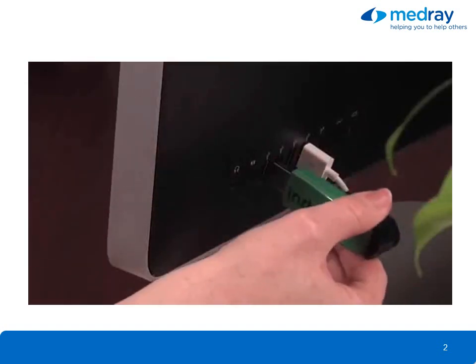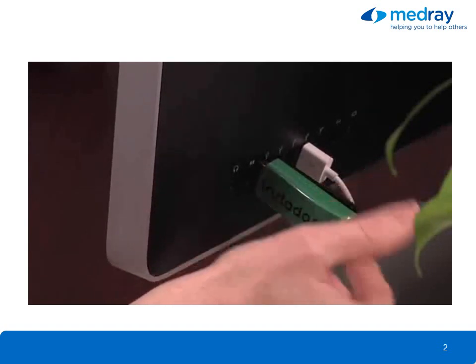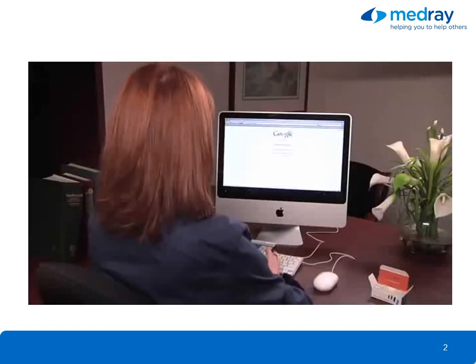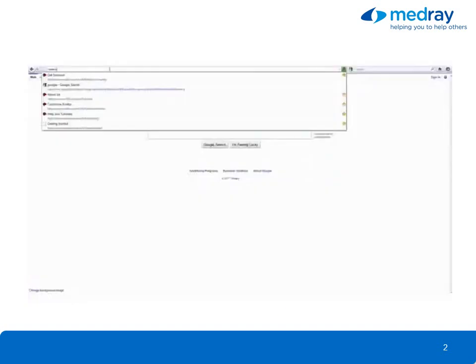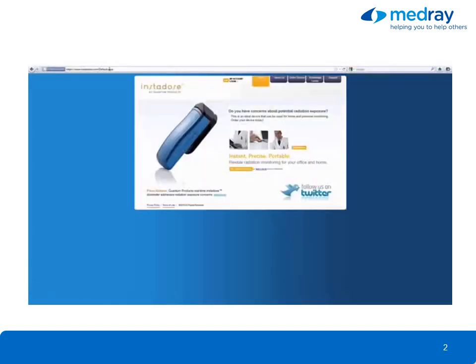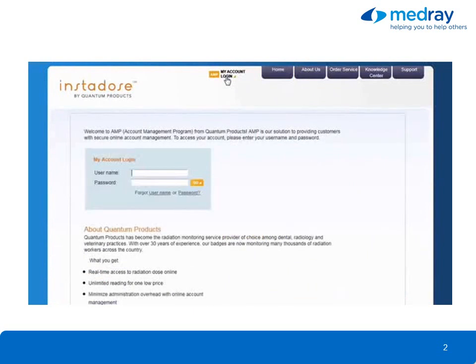To register and initialize your device, begin by plugging it into a USB port. Then type InstaDose.com into your web browser. Click on My Account Login, and enter your username and password found on the provided yellow card, and click Go.